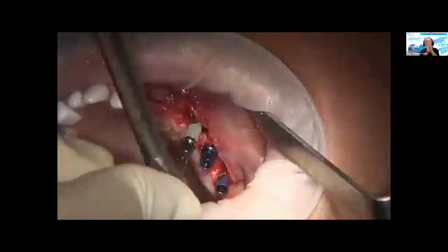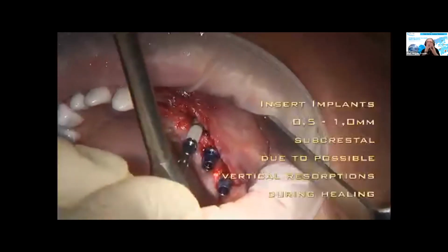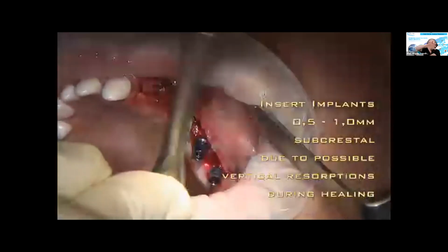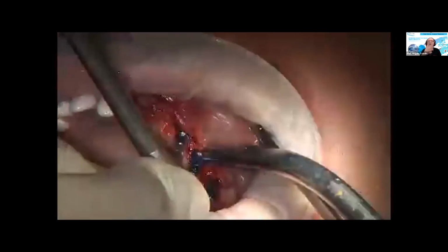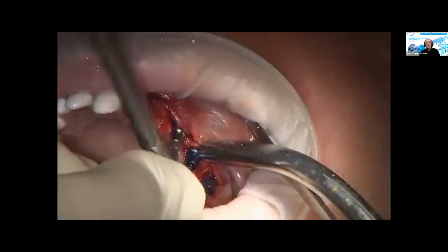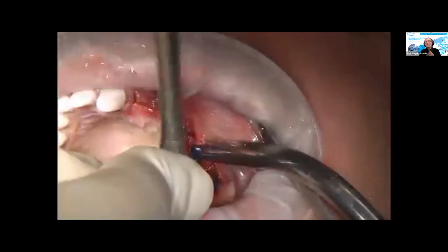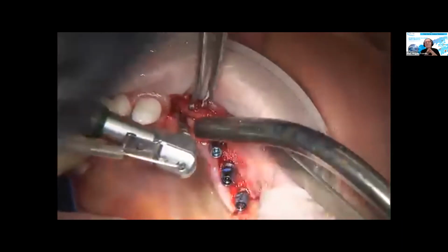So both for the maxilla and the mandible, if you manage an alveolar crest width of, let's say, 1 or 2 millimeters, please never let the drill run clockwise, because clockwise running of the drill means removal of the bone. If you let it run counterclockwise, it means just separation of the bone. There is no removal of the bone. And as you can see, an experienced implantologist immediately recognizes that I need a lot of force now to insert the implant. What does this mean?